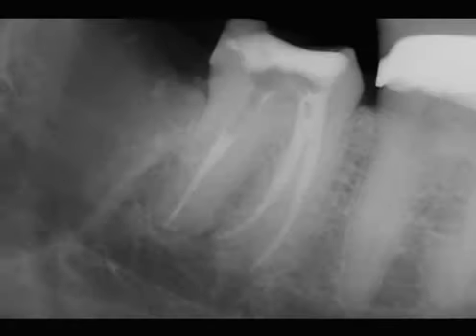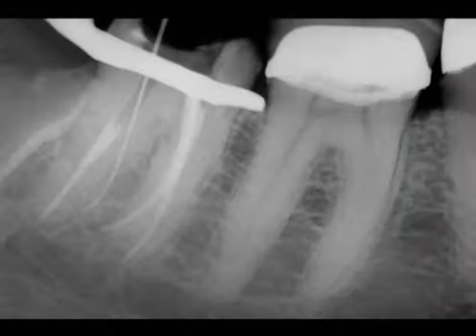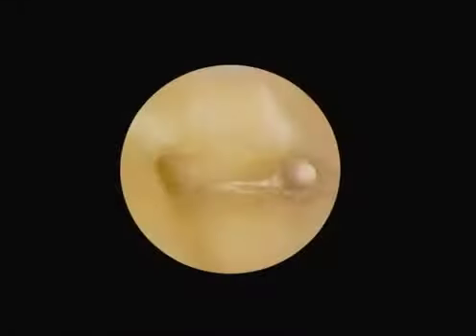An endodontically failing molar shows the obturation material within the distal root not centered. A photograph at high power into the centered distal orifice reveals obturation material positioned subcrestally in a fin off this canal. A working film shows a 15 file in the DL system and at the radiographic terminus. A photograph at 15 power shows a second distal lingual system.